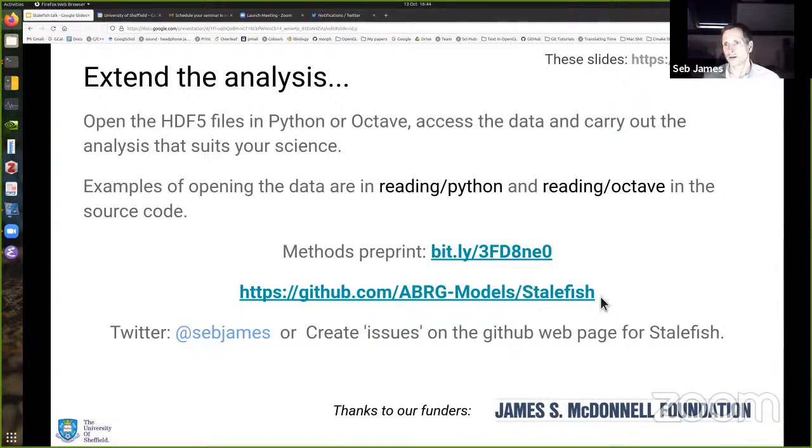Right. So I don't know if I missed this, but you're saying that you're developing this new kind of analysis. What are people using right now when they're not using Stalefish? Basically, how do they compare these different brains, and how do they align these things? Yeah, it's pretty much either making cartoon drawings and estimating, or using whole mount, where you just stain the entire brain without slicing it and look at the surface expression. That, as far as I'm aware, is what most people are doing.